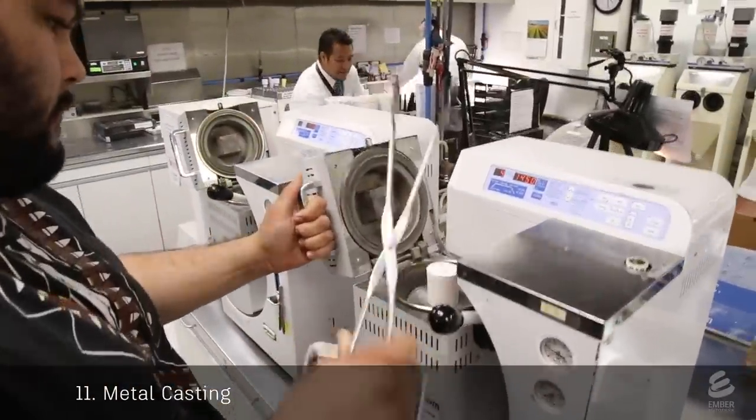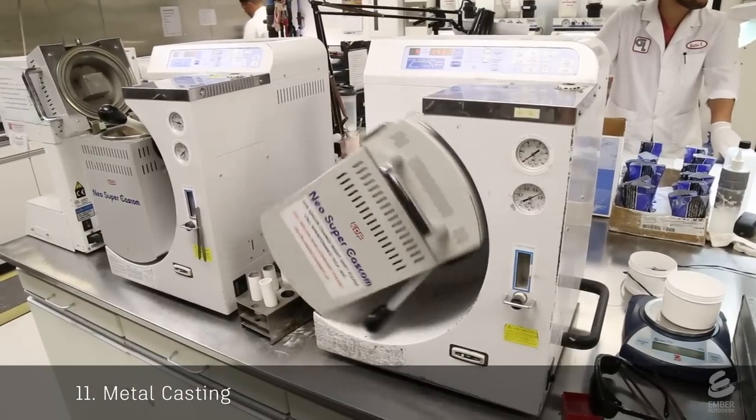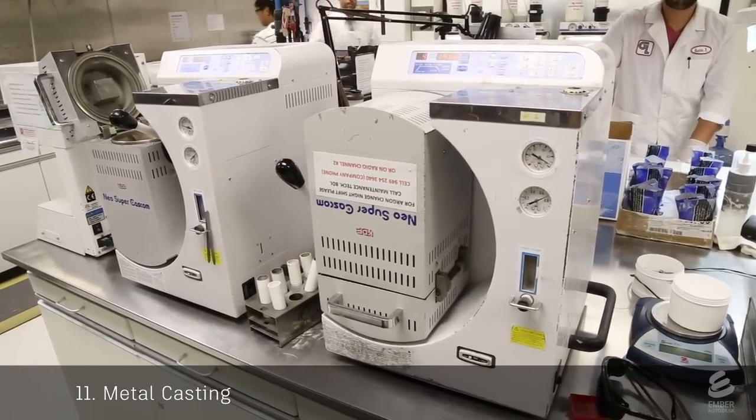Directly from the oven, the investment is inserted into a vacuum casting machine. Already inside is a precious metal alloy. The machine flips over and a vacuum pulls the molten metal into the void space.